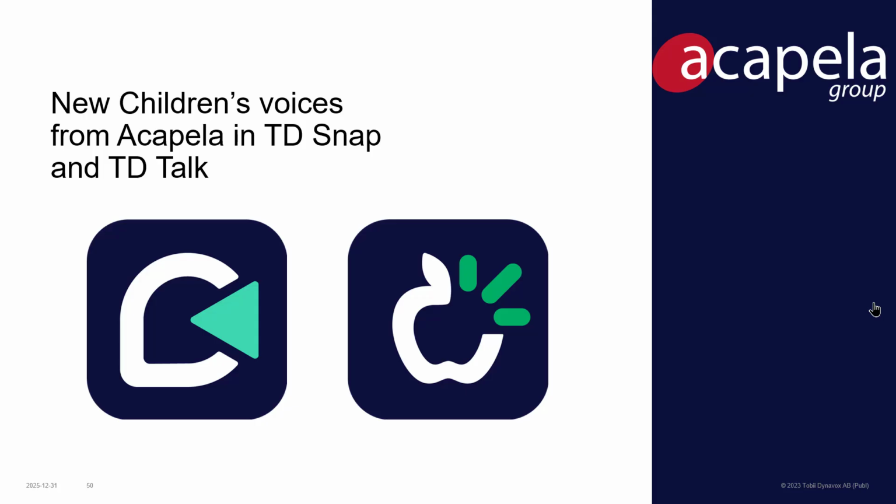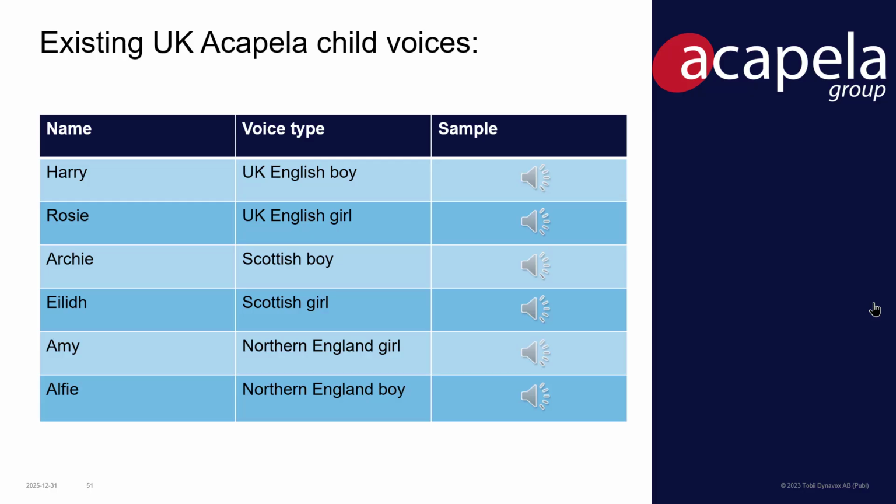The other thing I want to show you are the new children's voices from Acapela that are in TD Snap and TD Talk. This is Harry, the high-quality child voice from Acapela. This is Rosie, the high-quality child voice from Acapela.